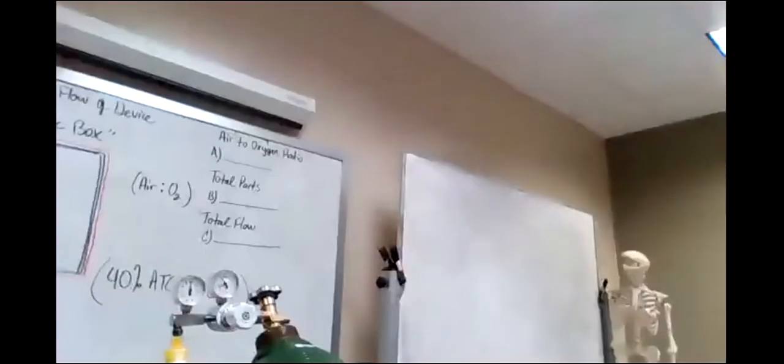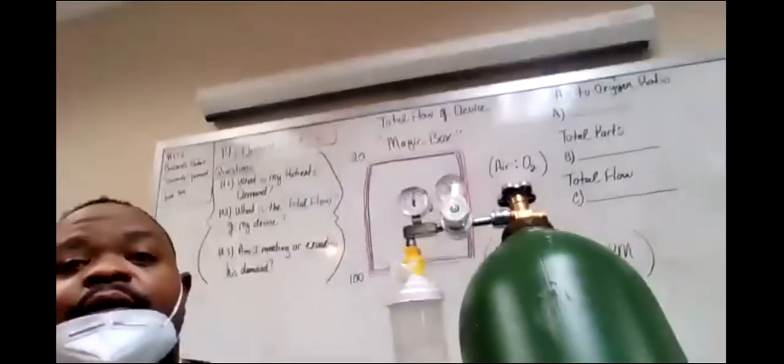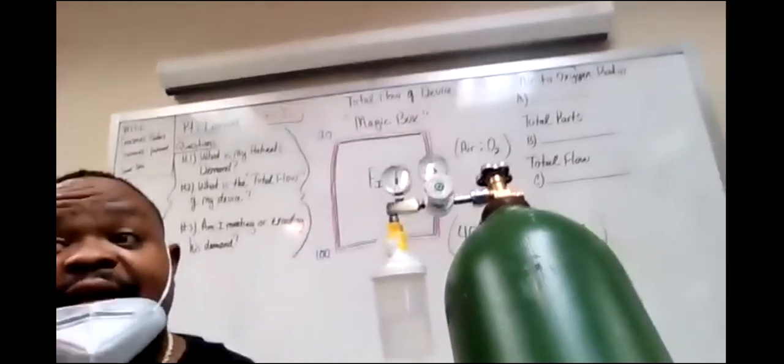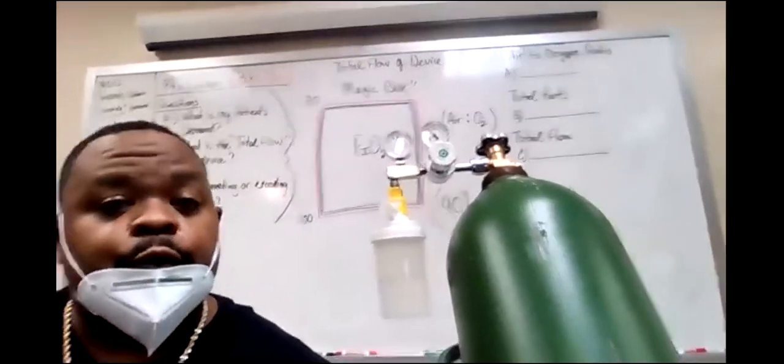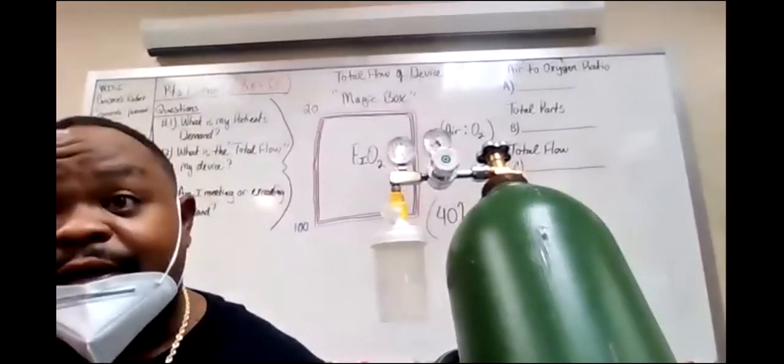Can you see the aerosol? You see the aerosol coming out of there? Because there's water in there, okay? The main reason is because when we start dealing with high flow systems, we need humidification, because most people who use a high flow system have a bypassed upper airway.